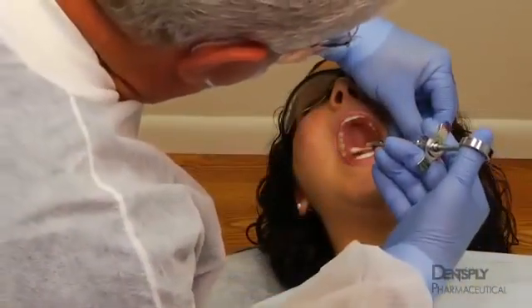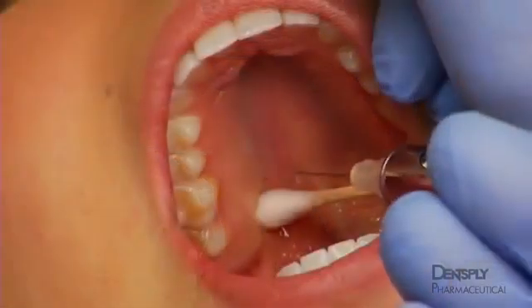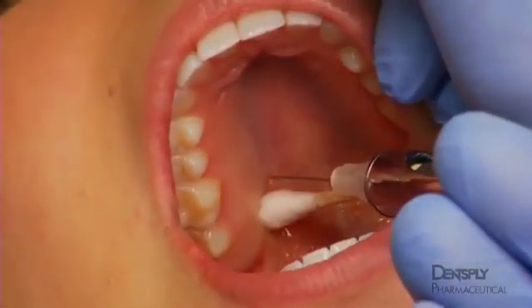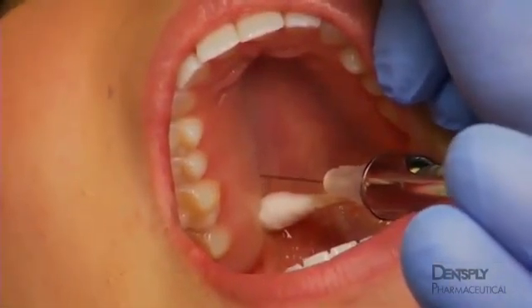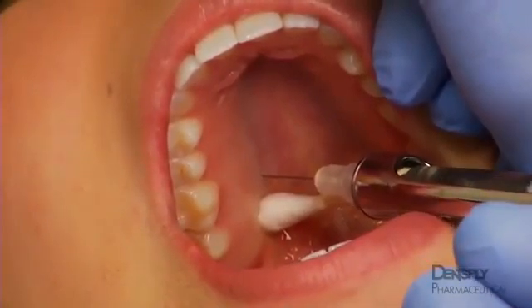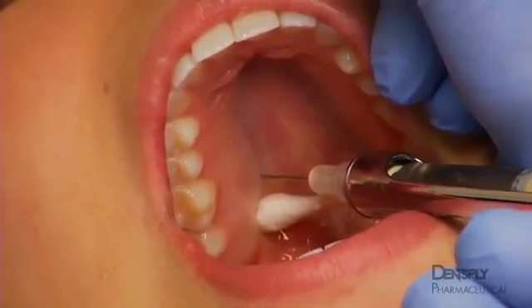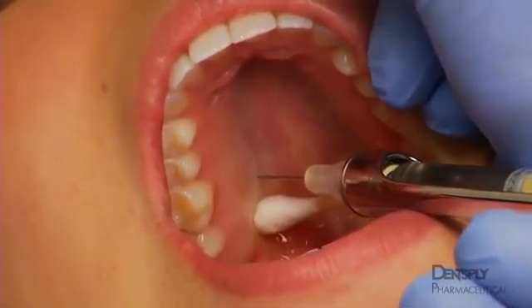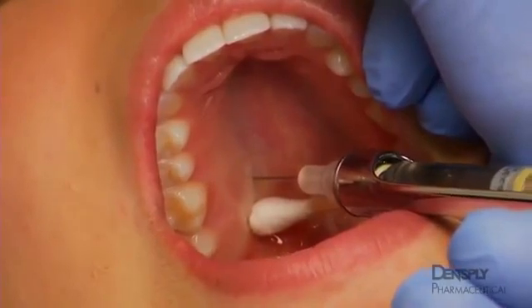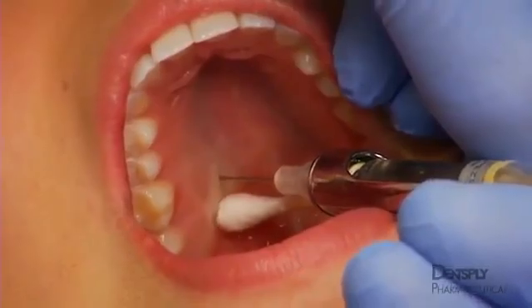Using a 27-gauge syringe, direct it from the contralateral side of the mouth at a 90-degree angle to the palate toward the cotton-tipped applicator. Insert the needle slightly anterior to the greater palatine foramen 3 to 6 millimeters until the palatine bone is contacted. Aspirate, slowly depositing approximately 0.45 milliliters of solution, about 1/4 of the cartridge.